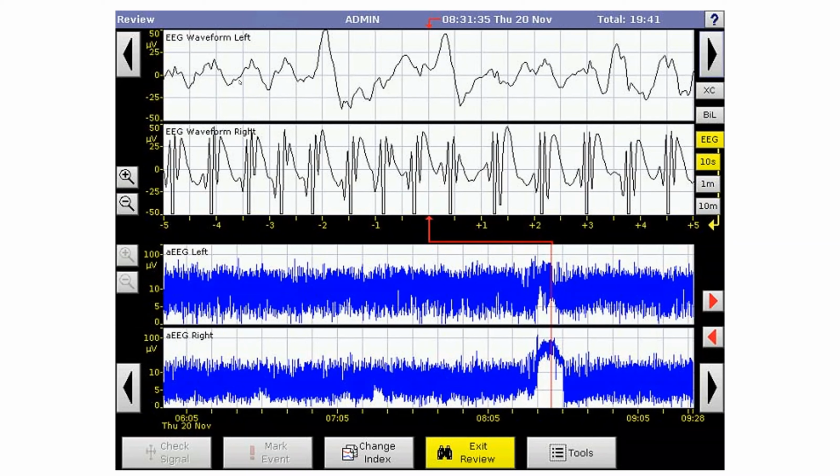This particular monitor screenshot is 10 seconds, each line up here representing one half of a second. So this is 5 seconds up to here, an additional 5 seconds. Depending on your screen length or the way you've set it, you may have 10 seconds or 15 seconds. But by definition, a seizure requires a rhythmic pattern that lasts for more than 10 seconds. We can see in this snapshot, this pattern is repetitive for the entire 10 seconds. The other way to think about it is, if I scroll this to the right or to the left, can I pretty much predict what I'm going to see? That's another indication of rhythmicity, when you can predict what you're going to see next.